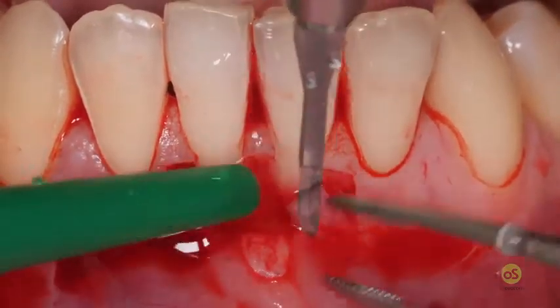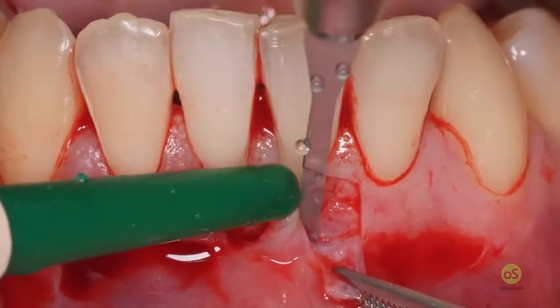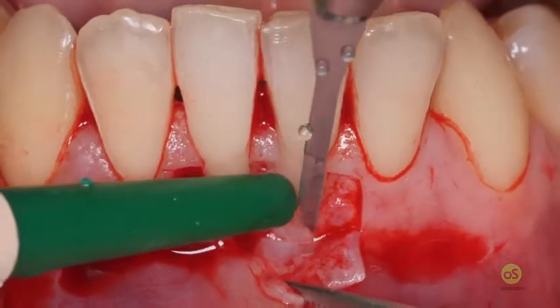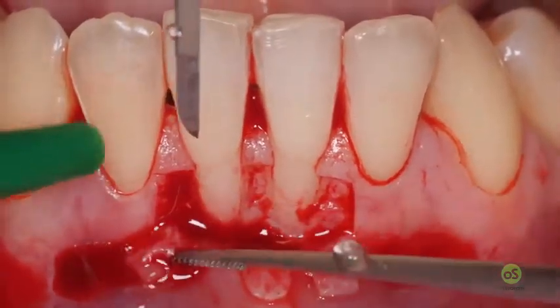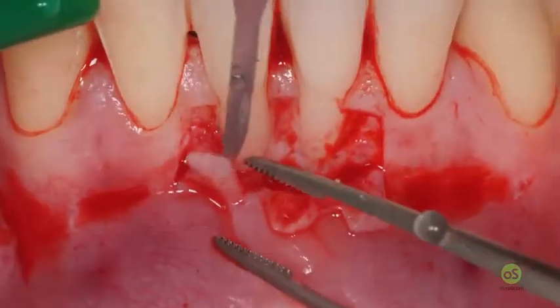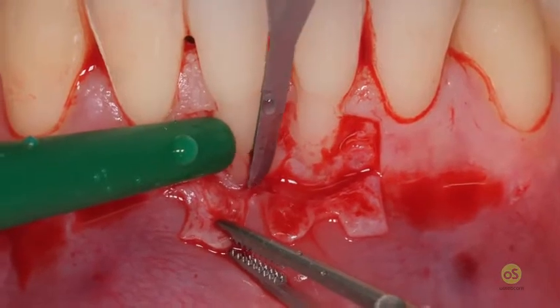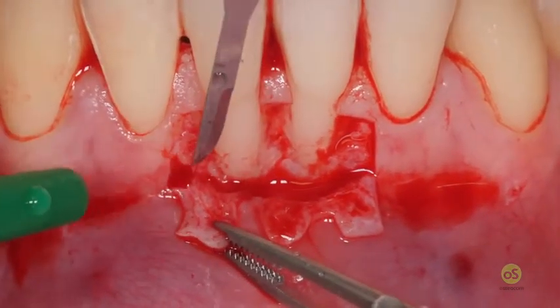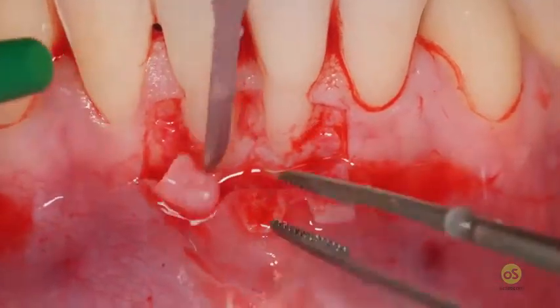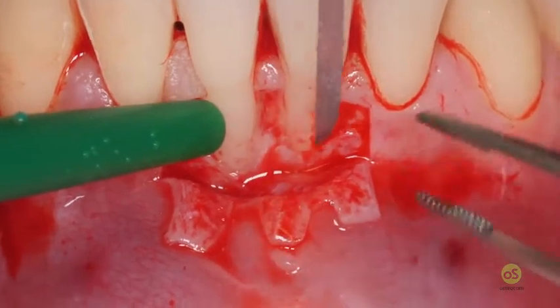so I'm keeping the blade parallel to the bone until I reach here, the buccal bone crest. Here the buccal bone crest is reached. Now I have to check here. This is the deepest recession. You see here the tissue is attached to the root. Look. Now I'm detaching them. Parallel to the bone. Now I reach the most apical extension of the bone.